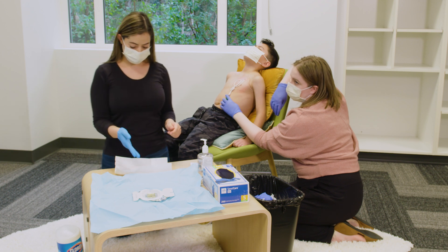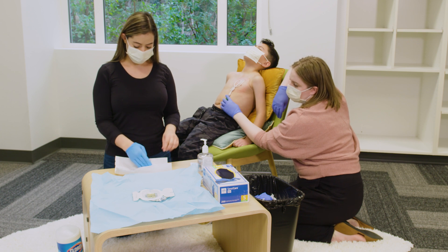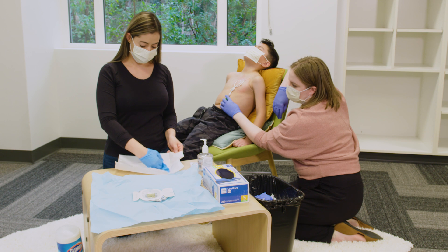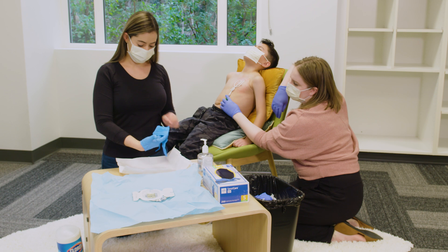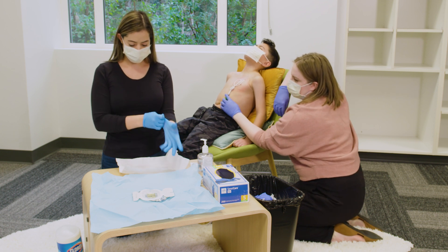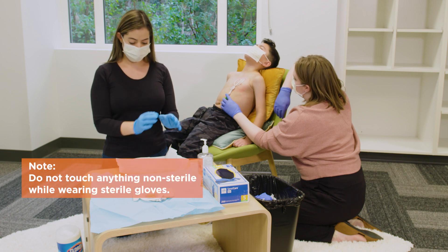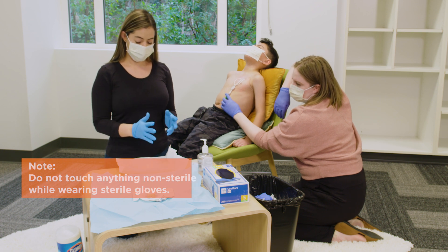Using your gloved hand, slide your fingers into the cuff of the second glove, only touching the outside of the glove with your gloved hand. Let the glove hang with the fingers pointing downward and slide your second hand into the glove. Adjust both gloves until they fit properly, only touching the outside of the gloves. Hold your hands above your waist to keep the gloves sterile. Now you are ready to touch the sterile supplies — be careful not to touch anything non-sterile.